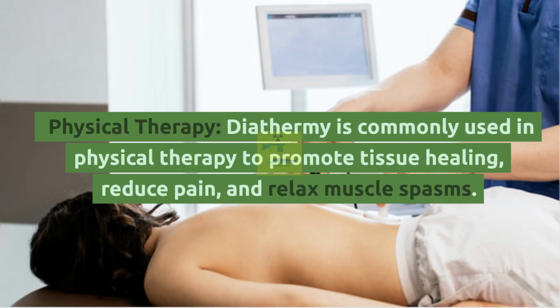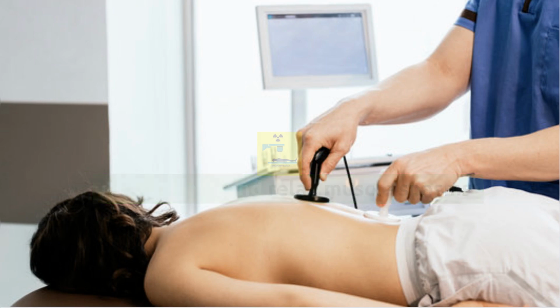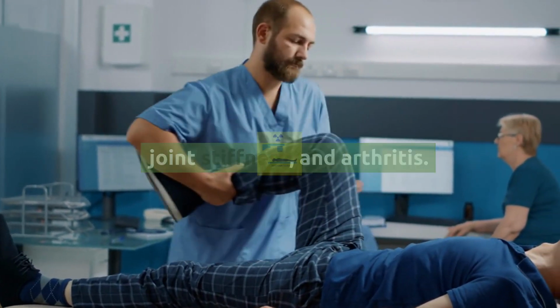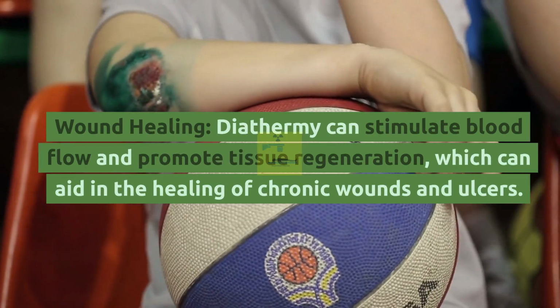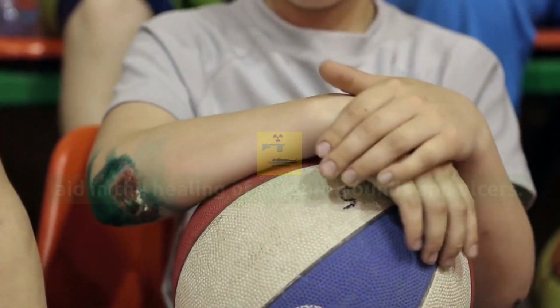Physical therapy. Diathermy is commonly used in physical therapy to promote tissue healing, reduce pain, and relax muscle spasms. It can help with conditions like muscle strains, joint stiffness, and arthritis. Wound healing. Diathermy can stimulate blood flow and promote tissue regeneration, which can aid in the healing of chronic wounds and ulcers.